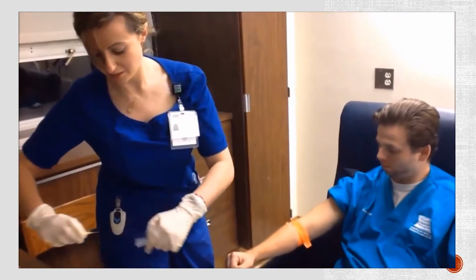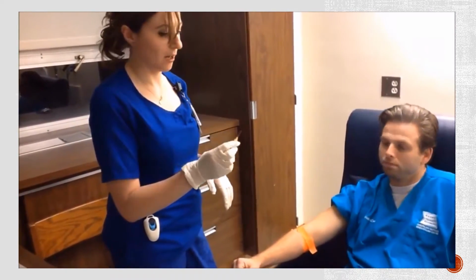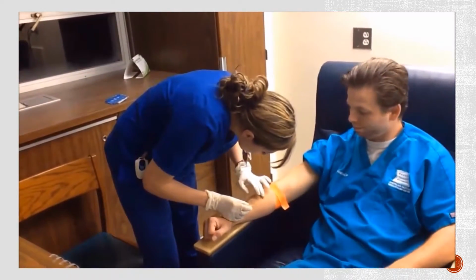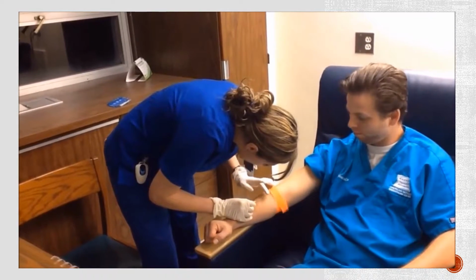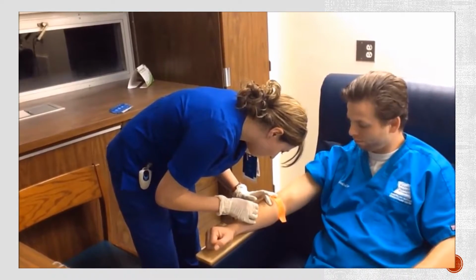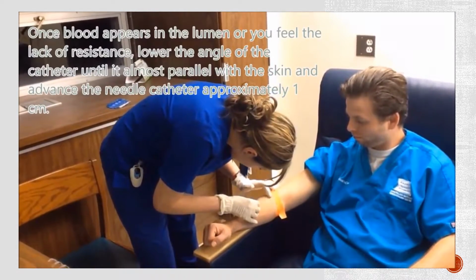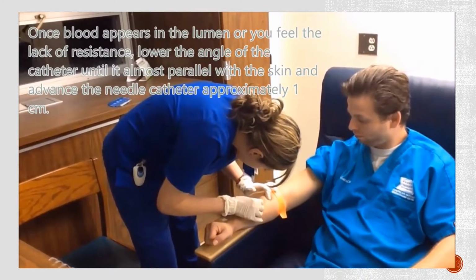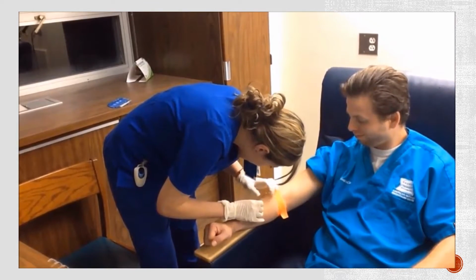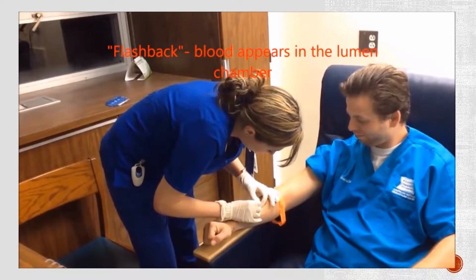Now I will apply the needle. Okay, you're going to have to apply it bevel up at a 15 to 30 degree angle. And hold the skin taut with your non-dominant hand as you go in. I've got flashback. Solid band.